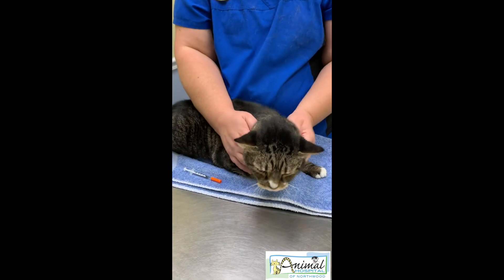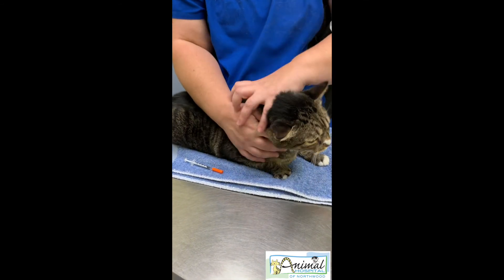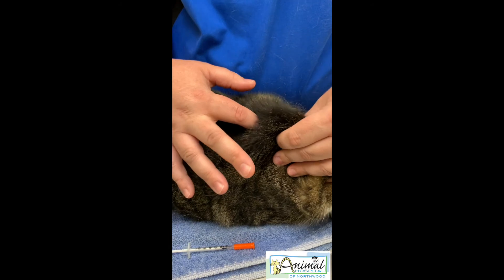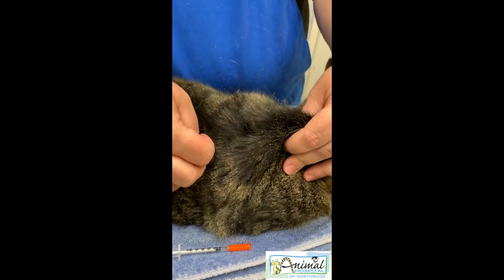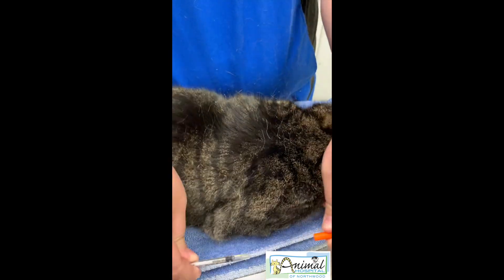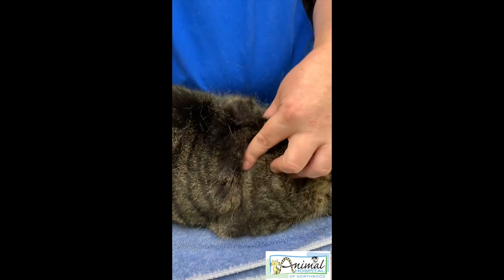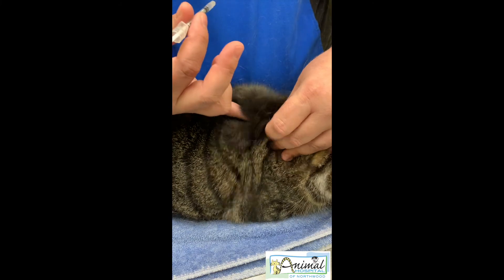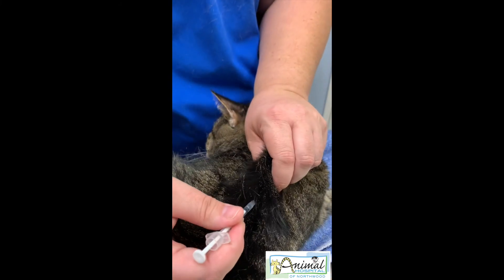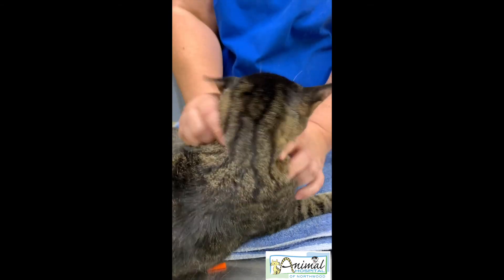We have Nala here ready for her injection. She's facing the same way as my demo, head up here, and we're going to use that extra skin between the shoulder blades — see all the extra skin? We'll make our tent. You can also use a little rubbing alcohol if you're having a hard time, and in some cases we'll shave the area. I'll decap my syringe, hold it in my thumb and forefinger, feel for my indentation with my pinky, and inject at a 45-degree angle — just like that. And see, Nala didn't even notice. You are a good patient, Nala.